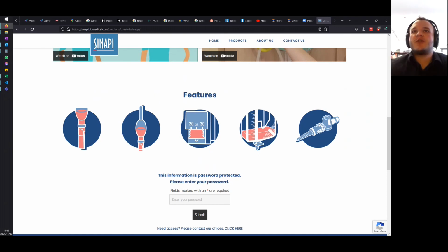It also preps you for what you'd see when you actually go ahead and do the physical testing. As I said before, a lot of our results lined up quite closely with what was shown in the simulations. So that sped up prototyping time as we already knew what to expect.